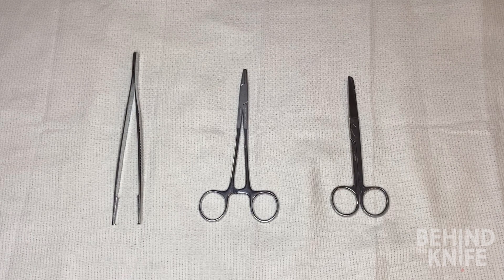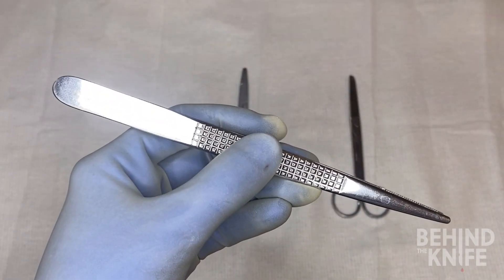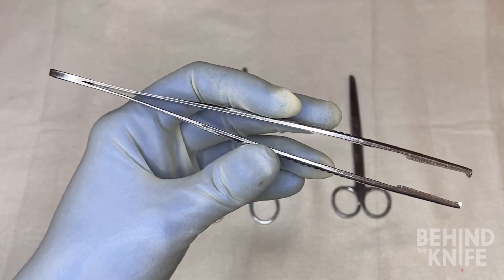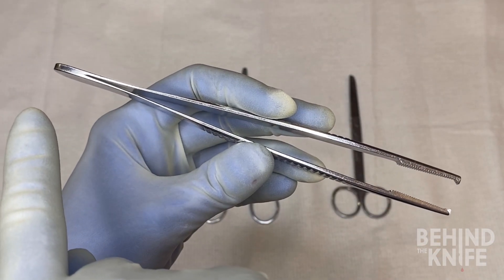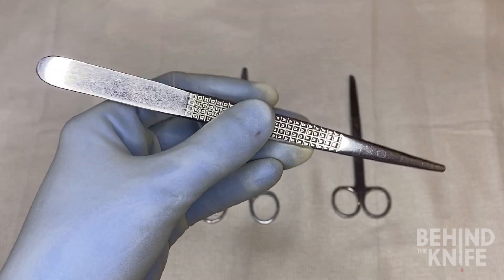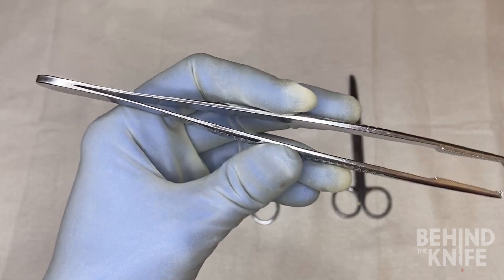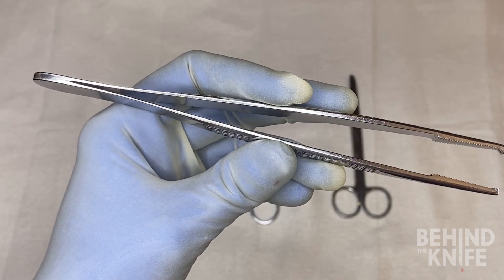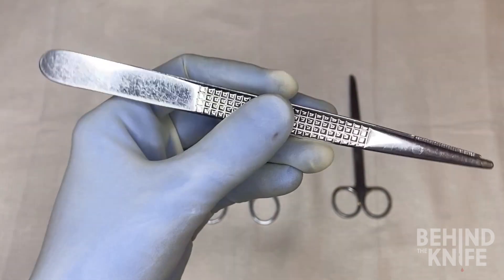The first instrument we're going to start with is the forcep. The best way to use this is to hold it like a pencil in your hand. You generally don't want to be too close or too far away from the tip of the instrument — somewhere in the middle is best. Many of us will want to apply a lot of pressure when using this instrument to pick up tissue, but that generally isn't needed and may even cause your forcep tips to cross. Gentle to moderate pressure is all that is needed.